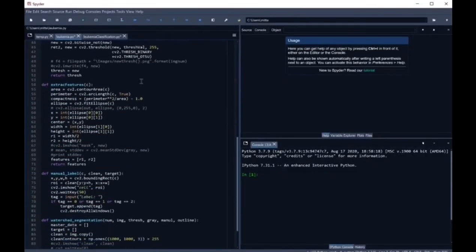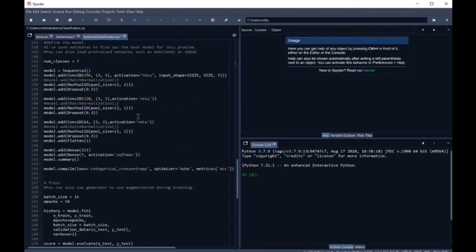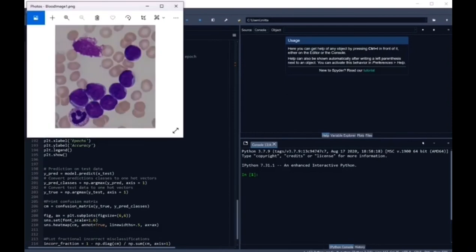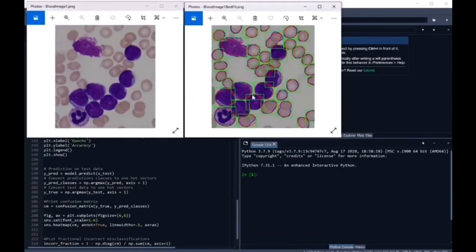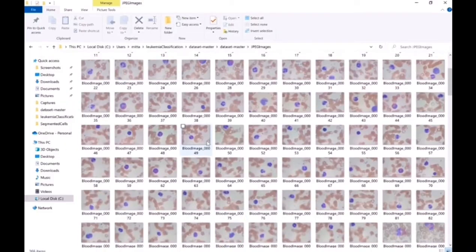The second and third steps of our process were the segmentation and interpretation done by our algorithm. First, the program thresholded the image into black and white and then located the centers of different cells to identify the outline using the watershed algorithm. To analyze each of these images, the AI outlined the cell using contours, then calculated the best fit ellipse to determine its features like perimeter and area, and also found the best fit rectangle to separate each of the cells into individual files that increase the volume of data.